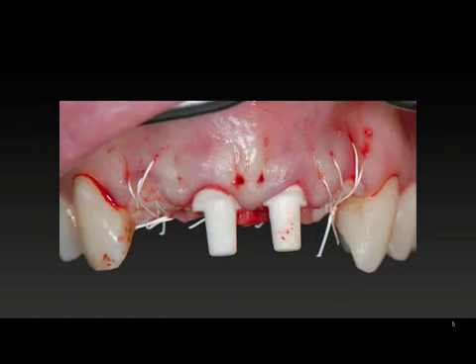Our treatment plan was the extraction of those 4 incisors and the placement of 2 CeraRoot 21s in the central incisor sites, and then creating a 4-unit bridge with cantilevered laterals, giving us the aesthetic result. The reason that we do a bridge that's formed like this, as opposed to the classic 2 implants in the lateral incisor areas, is strength.